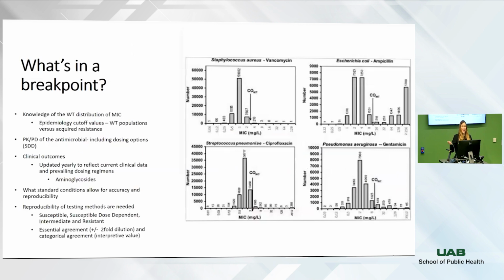So what do the S, I and R values mean? If I tell you E. coli is susceptible to ceftriaxone, what does that mean? It means it works on E. coli. No matter how much ceftriaxone I give a patient, it's going to work? Or do I still have to give a certain dosage to the patient? I still have to give a certain dosage to the patient?